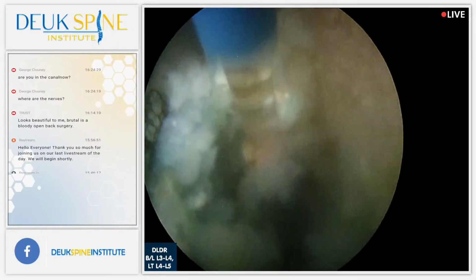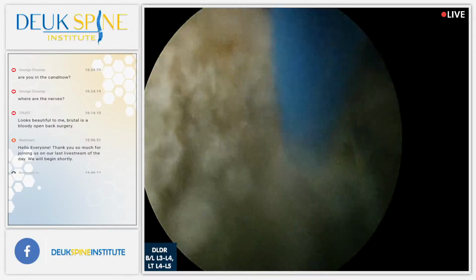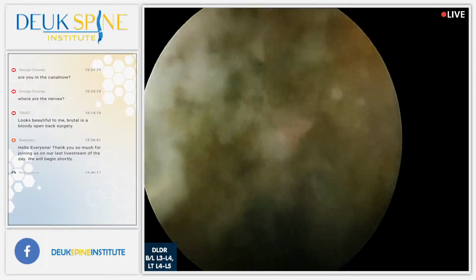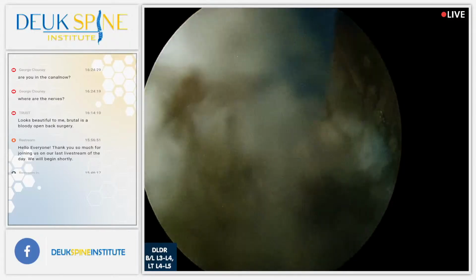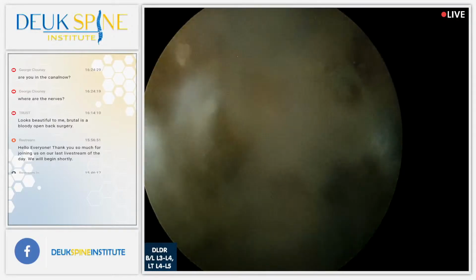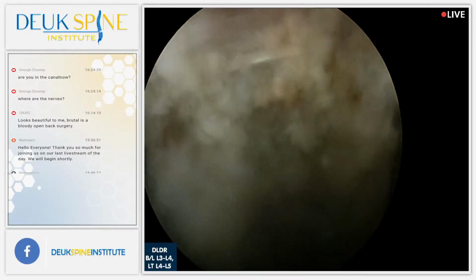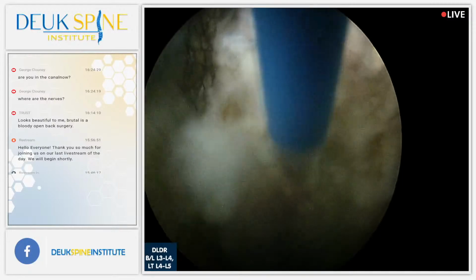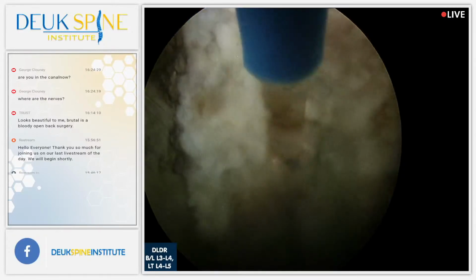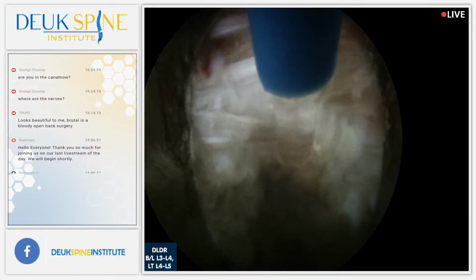We have a question. This comes from George Clooney, and they asked, where are the nerves? Are you in the canal now? Great question. So George Clooney, first of all, we're inside the disc. Because we're inside the disc, you're not going to see the nerves. That's the beauty of this treatment, is that we stay away from the nerves on purpose. And we go straight to where the problem is.